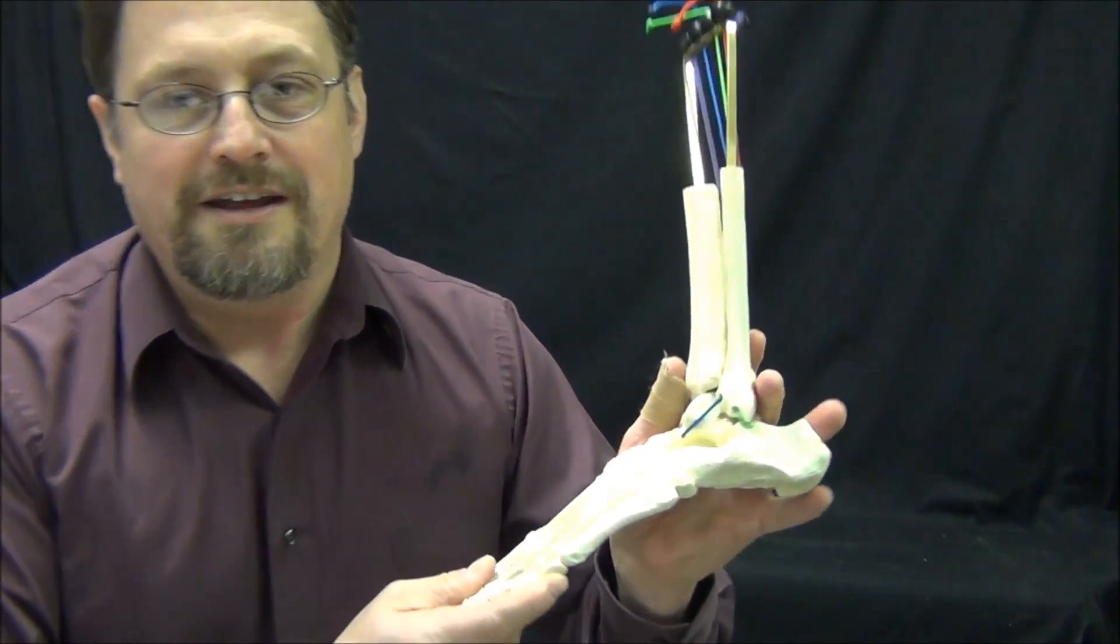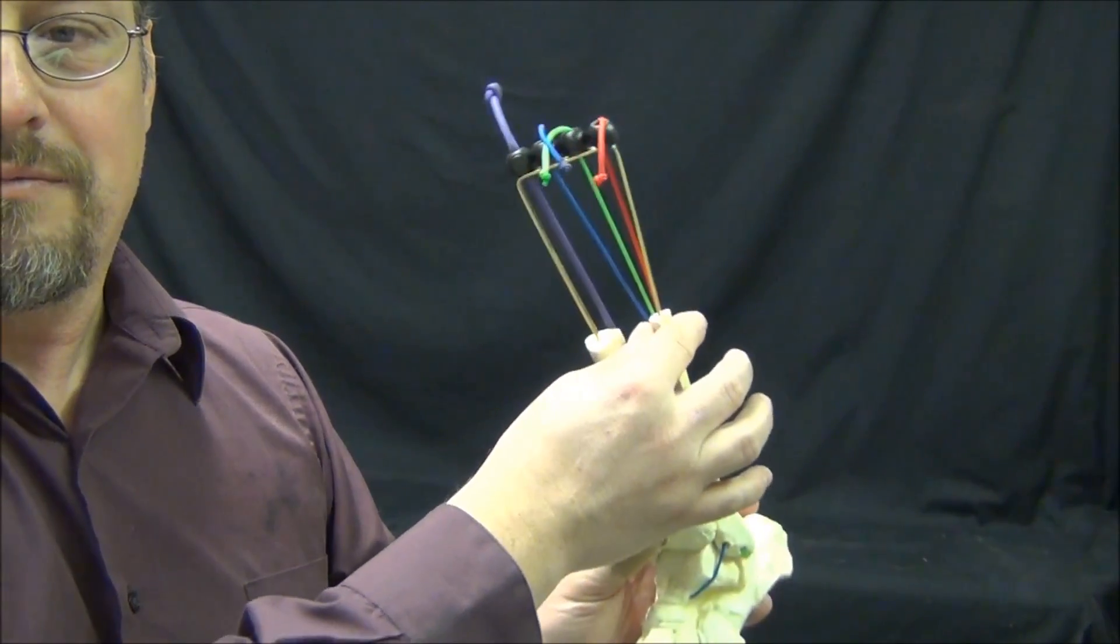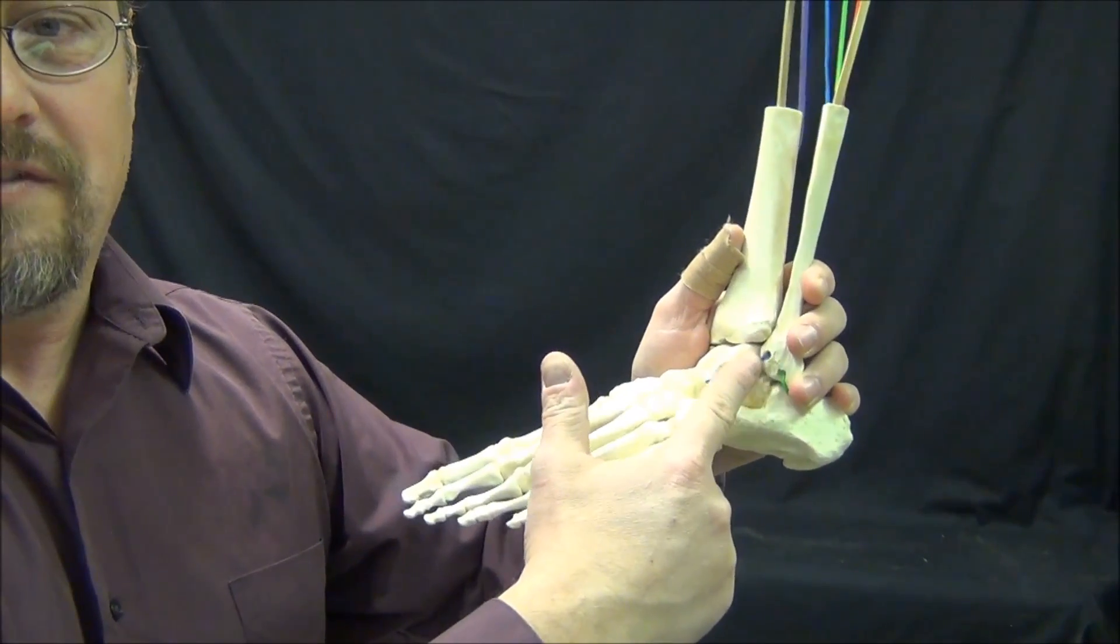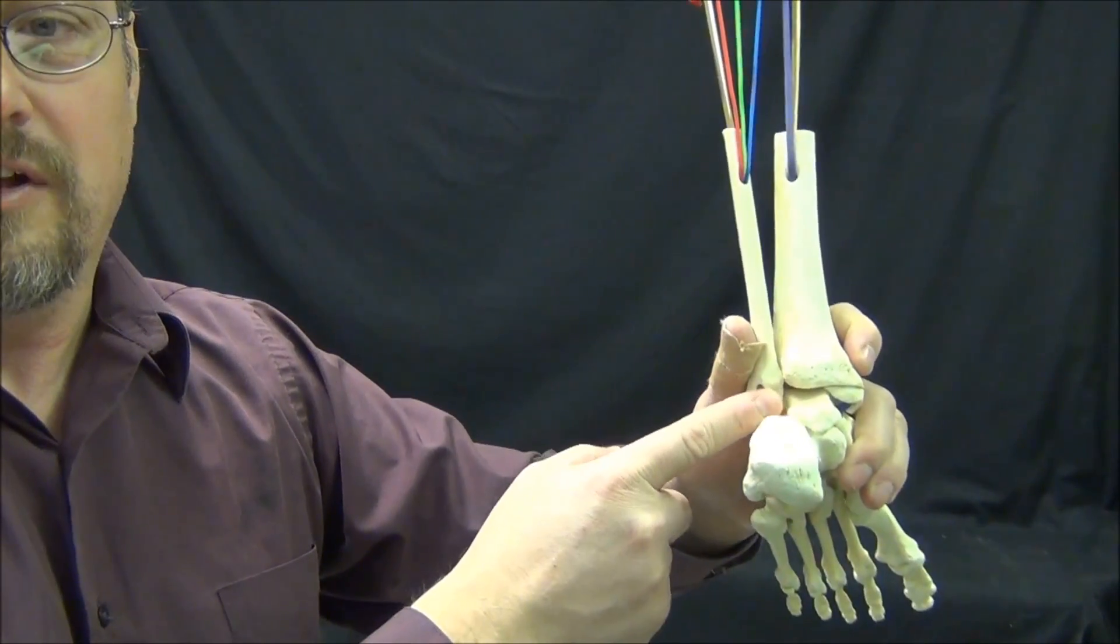What you'll see here is that there are paracord ligaments running from the base up here down across the ankle, taking the route of the anterior talofibular ligament, the calcaneofibular ligament, and the posterior talofibular ligament.